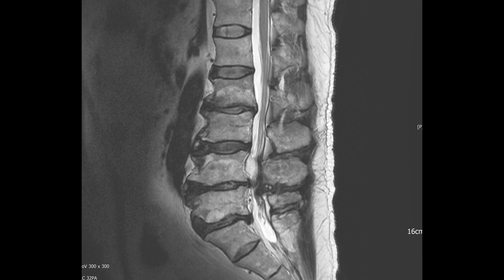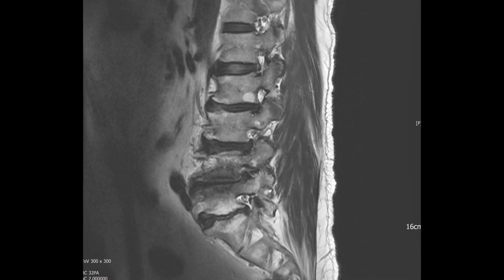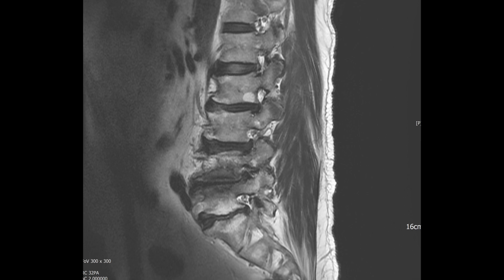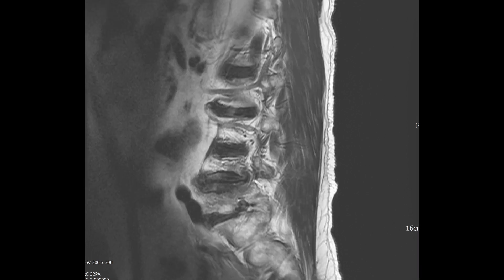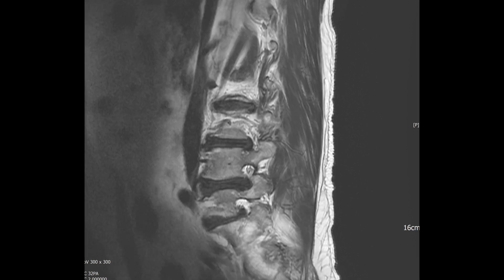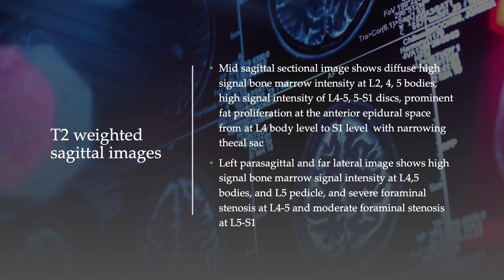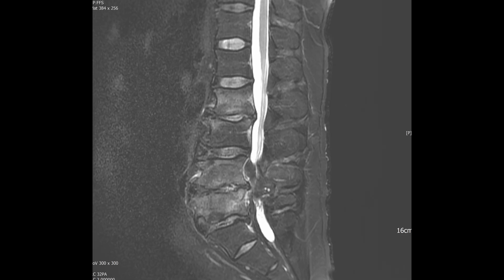A closer examination of the left perisagittal sectional image uncovers severe foraminal stenosis at L4-5, accompanied by subchondral low signal intensity and moderate foraminal stenosis at L5-S1. Meanwhile, the right perisagittal sectional image highlights mild foraminal stenosis. Turning our attention to T2-weighted sagittal images, the mid-sagittal sectional discloses diffuse high signal intensity in the bone marrow of L2, L4, and L5 vertebral bodies.